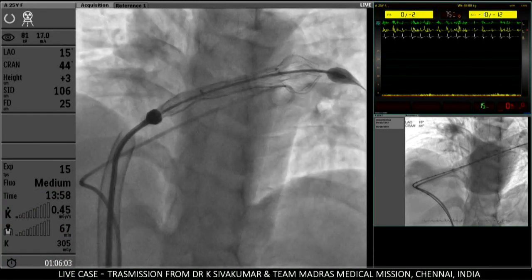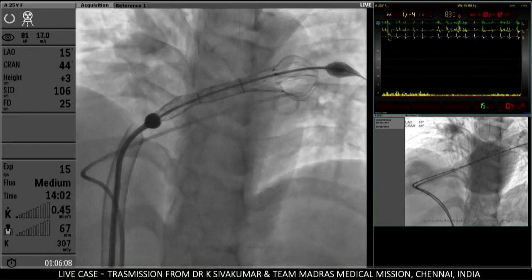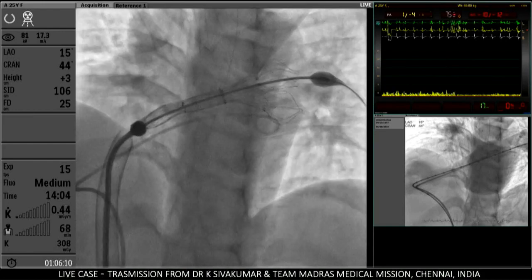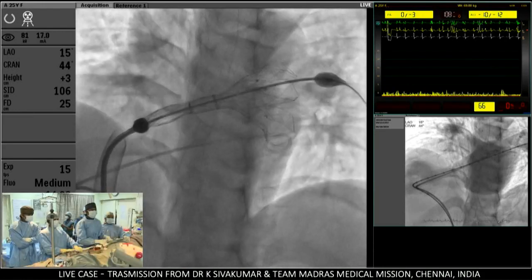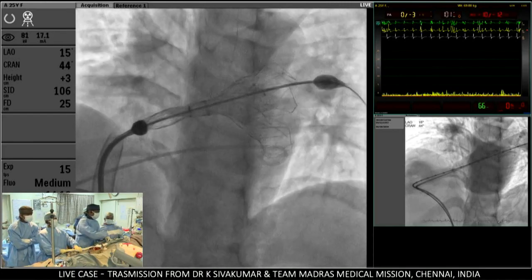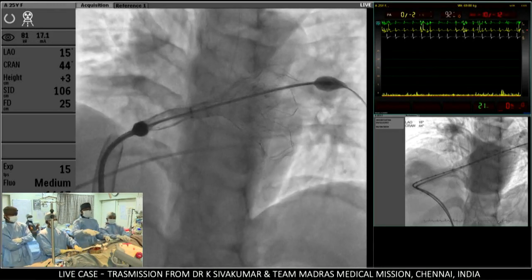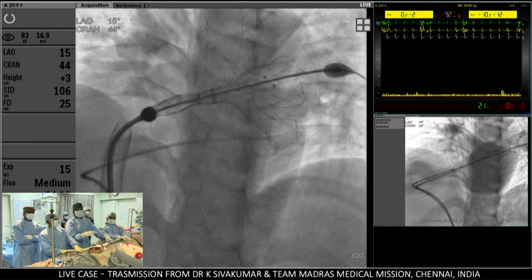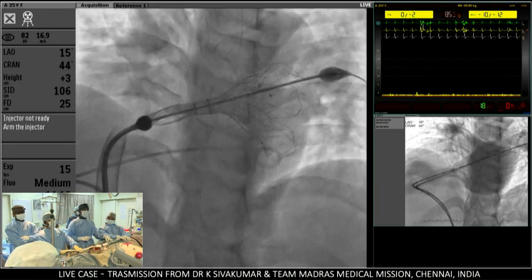yeah, keep it. Well, I think that the size of the main PA is so huge that I suspect the distal flare will be fully open in the main PA actually, without having a contact. Yeah? Because the 36 means that, stay there. Now show me, give me complete, 20 at 18. 20 at 18.